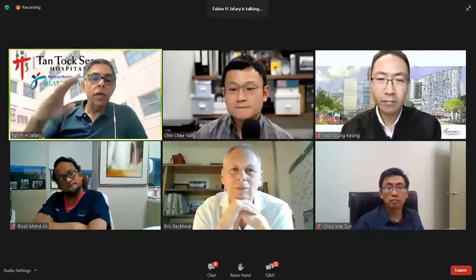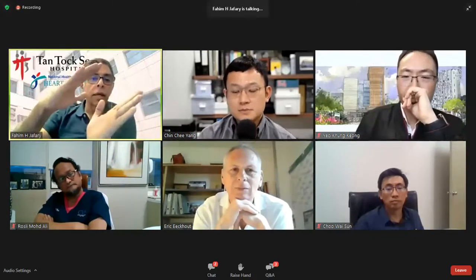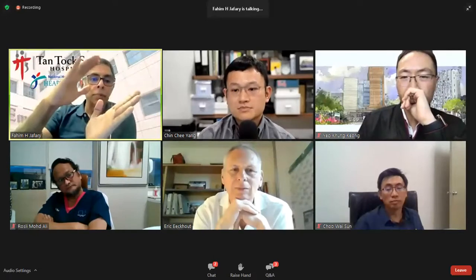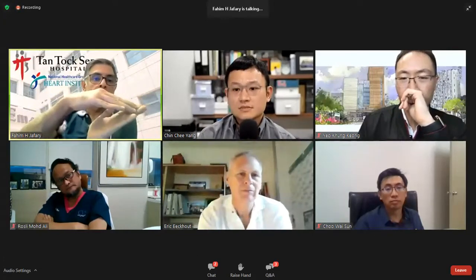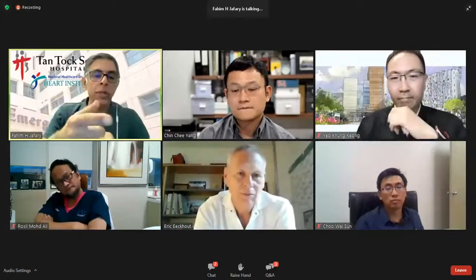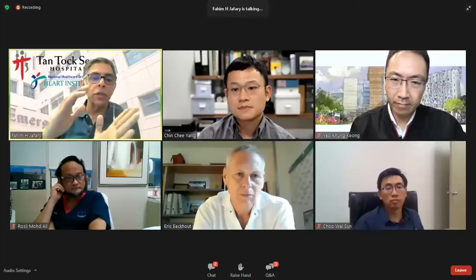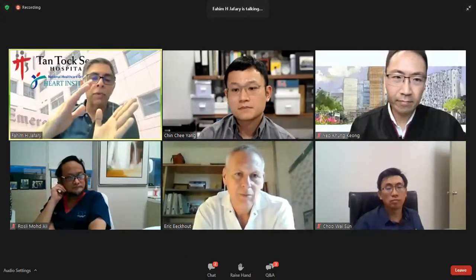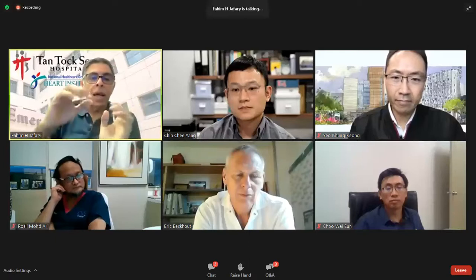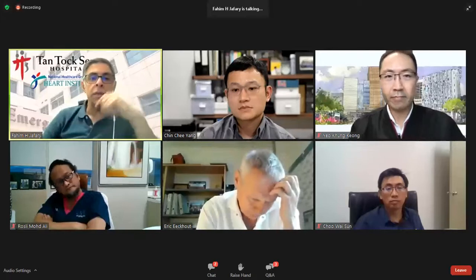If you're protruding a lot of it inside, then yes, both markers will essentially come together. Yep. But I think this is where I was alluding to the question I was trying to ask you earlier, that it's essentially a micro crush. I mean, you really are protruding just a little bit in, and then when you crush it, you don't get a whole lot of movement. You just get enough scaffolding of the ostium that's just right.